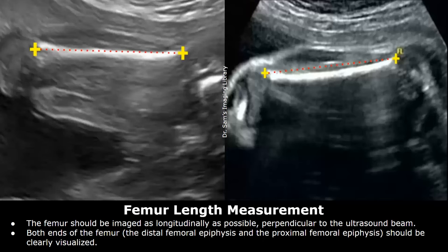After the femur is located, it should be imaged as longitudinally as possible. Its full length should be seen, and it should be perpendicular to the ultrasound beam. Try to obtain a right angle between the ultrasound beam and the femur.